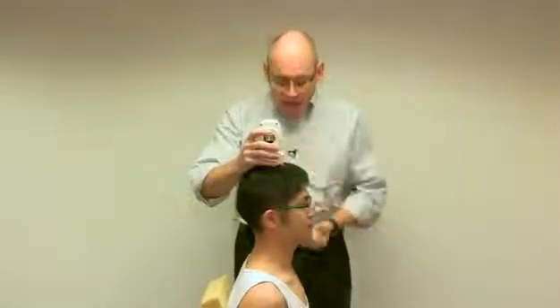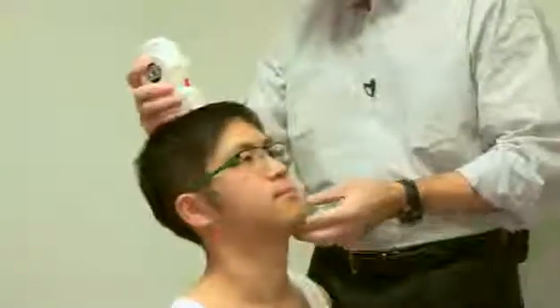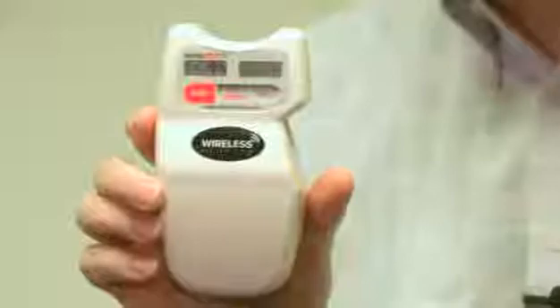Now we're going to measure neck extension in the sagittal plane. He's lined up so the base of his ear and the base of his nose are in a horizontal line. I set the inclinometer on top of his head and ask him to drop the back of his head towards the back of the chair. I set it again and hit it one more time, giving us 94 degrees of extension. We can get his total sagittal plane motion by adding the flexion and extension values.